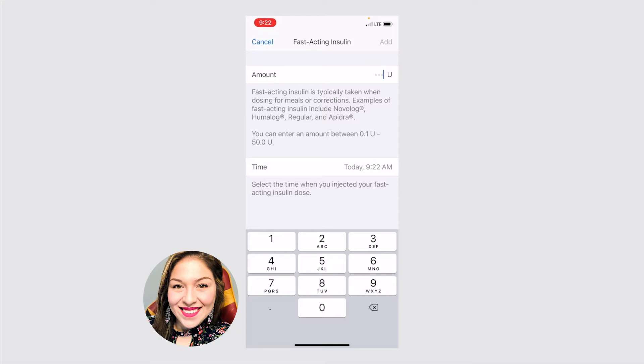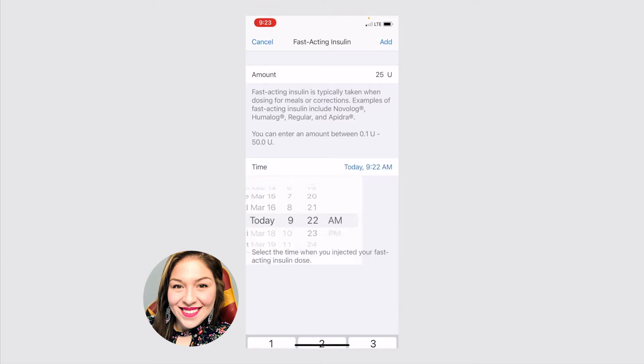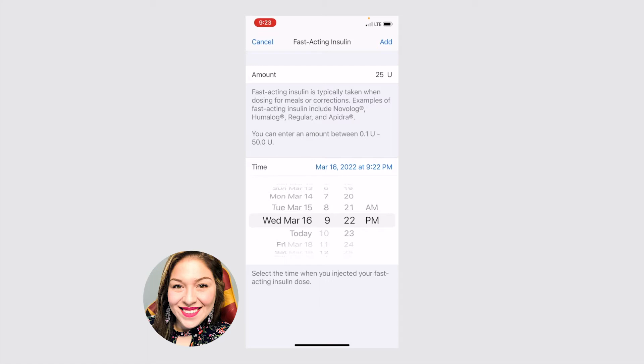If this doesn't sound like the insulin you're taking, then you can go back and look at the long acting insulin. You can just type in however many units you took for your meal. And if you're like me, and you forget to log right when you take it, you can adjust the time and setting. Let's say I forgot to log my insulin yesterday, right before bed, I took 25 units. You can change that. That way you can go back and add it after you've taken it.